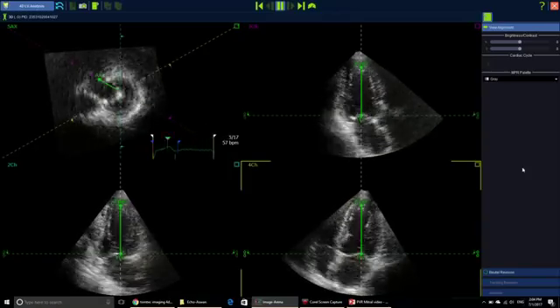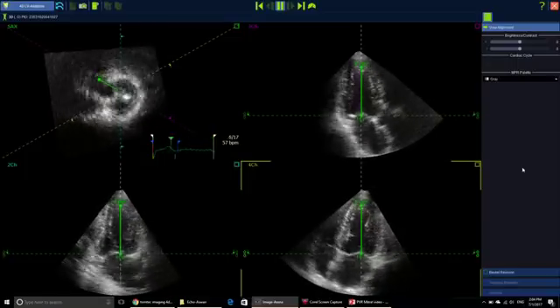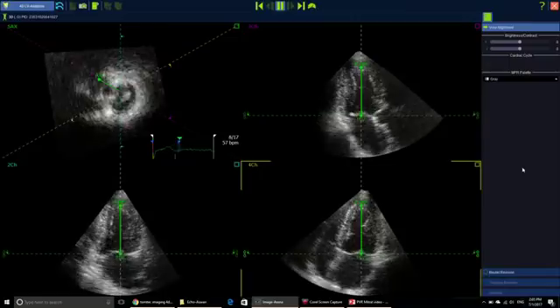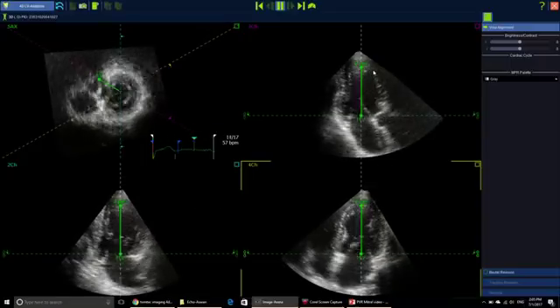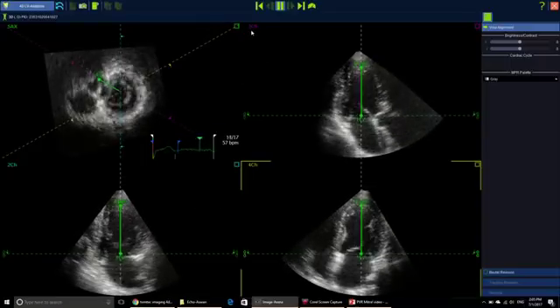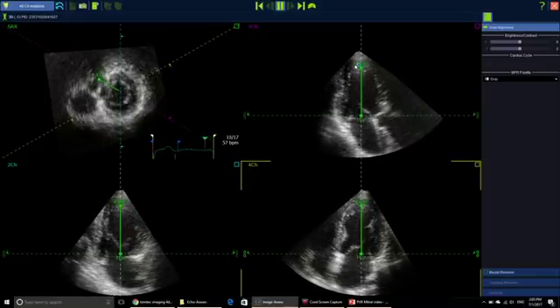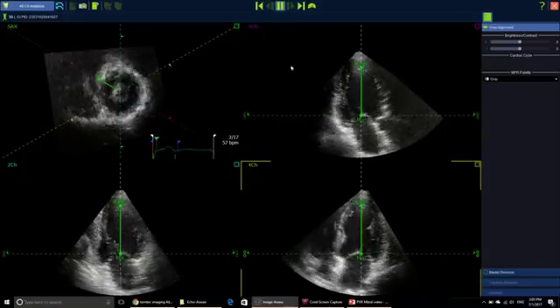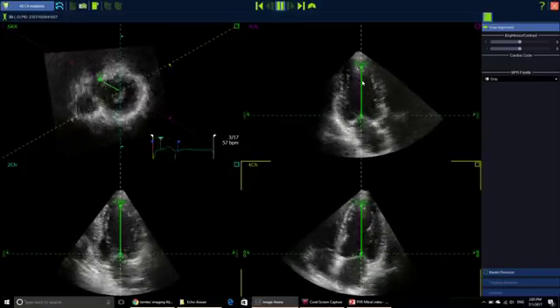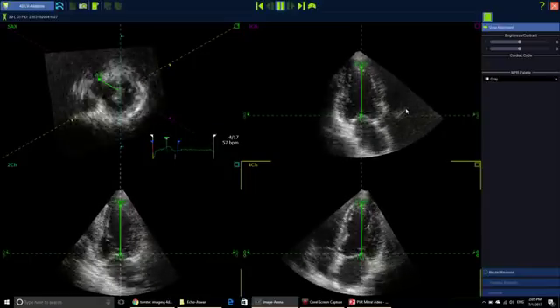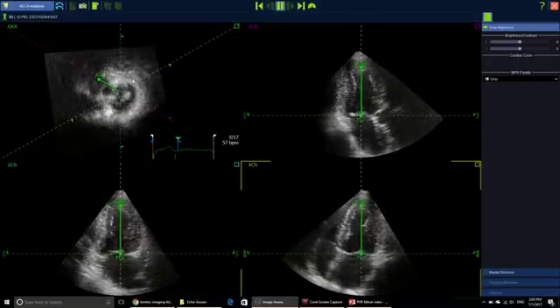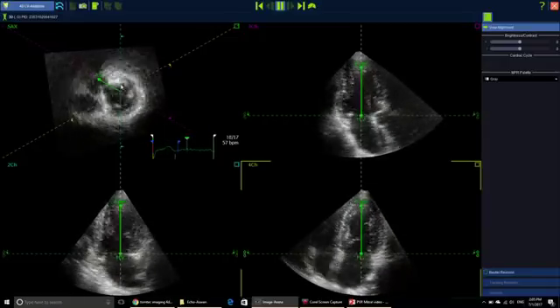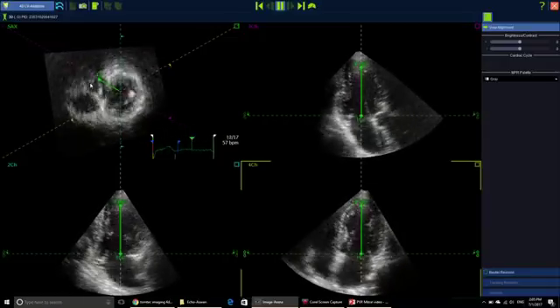This software is really very smart. Once you open the 4D analysis tool, it knows that you should be opening a volume that has the left ventricle in it, and it spontaneously divides this particular volume into four small screens. That one is a three-chamber view with the mitral valve pointing down and the apex pointing upward. It is preferred to be at the endocardial surface, and this is the middle of the mitral valve. Here is a short axis at the level of the left ventricle with this point pointing towards the aortic valve.